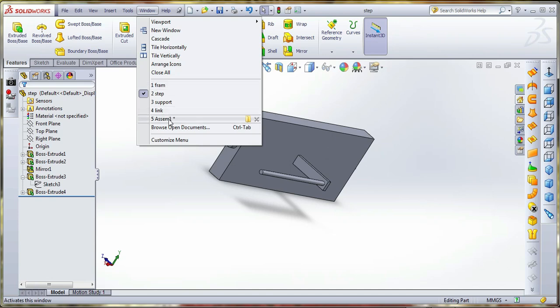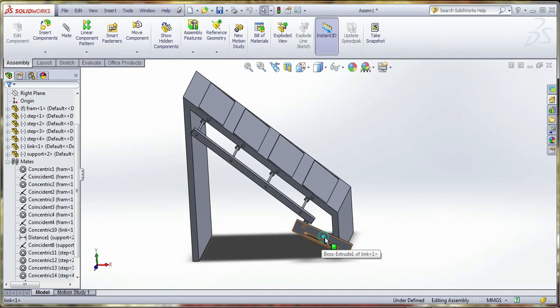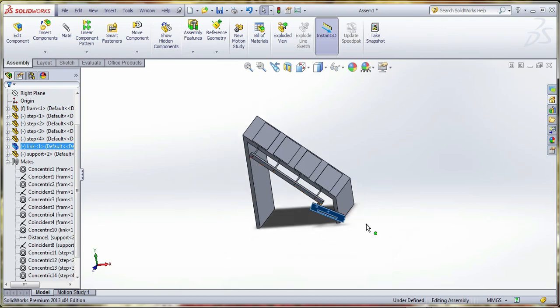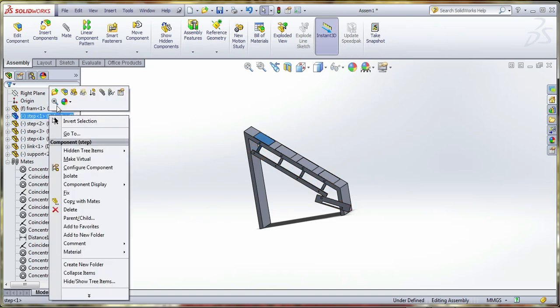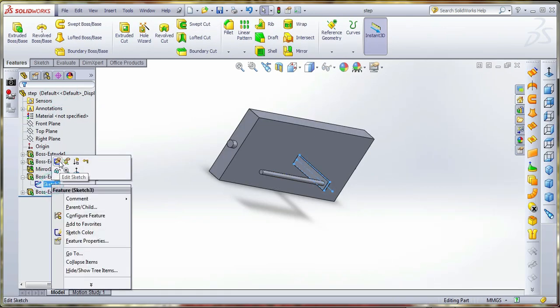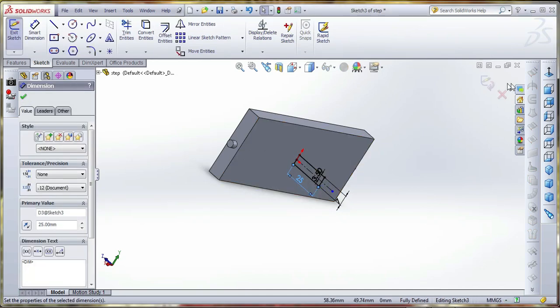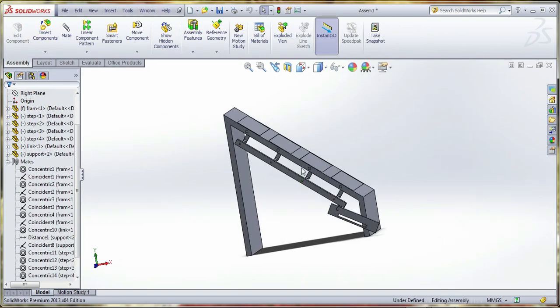Okay, and open the assembly session. Again you can reduce to 25. Again we can reduce 30 to 25. Okay, save, open, assembly. Okay, now it is okay.